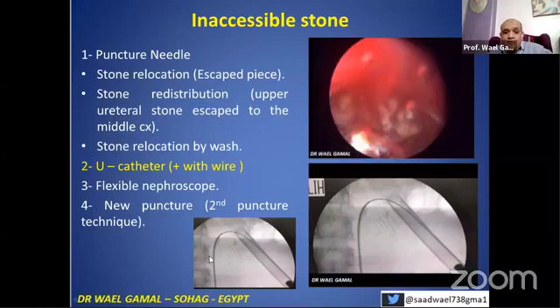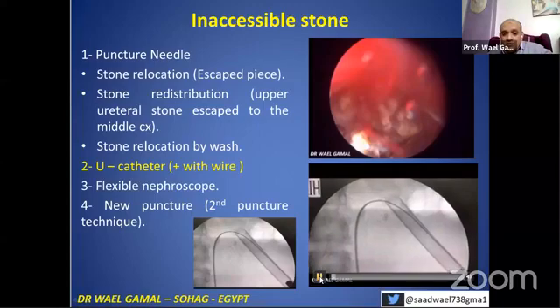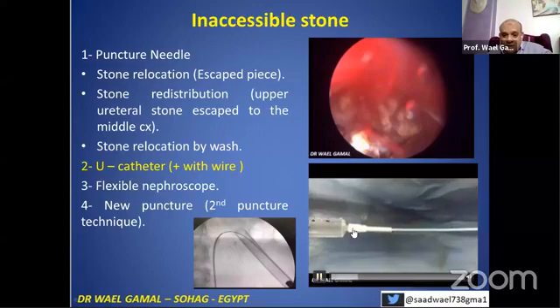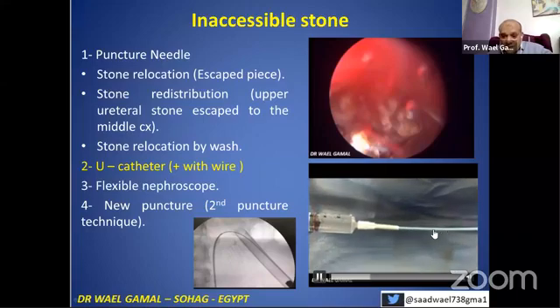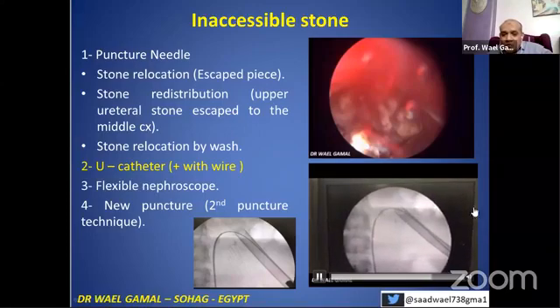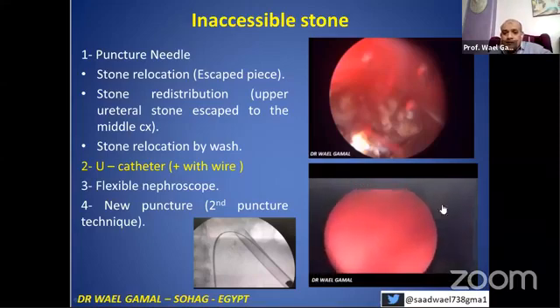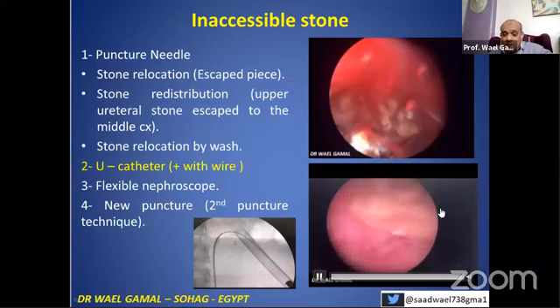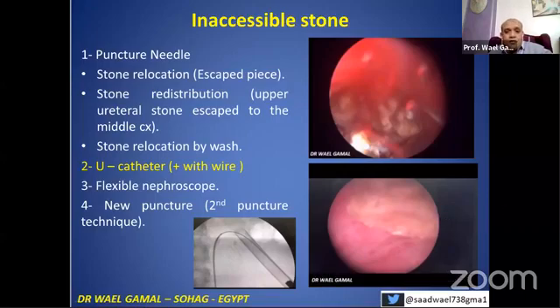Sometimes we have a through-and-through guide wire and there is a stone that has escaped and I cannot take this angle. Withdraw the guide wire — the guide wire is inside — but remove it from the distal part and you can inject with the ureteral catheter even with the guide wire inside. I need just one centimeter to be able to remove the stone. The stone is pushed with the guide wire inside the ureteral catheter and is now in front of the nephroscope.